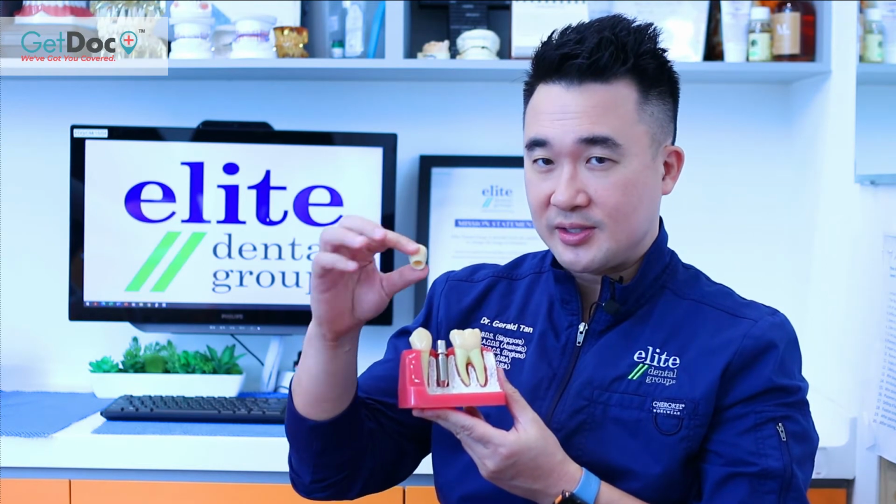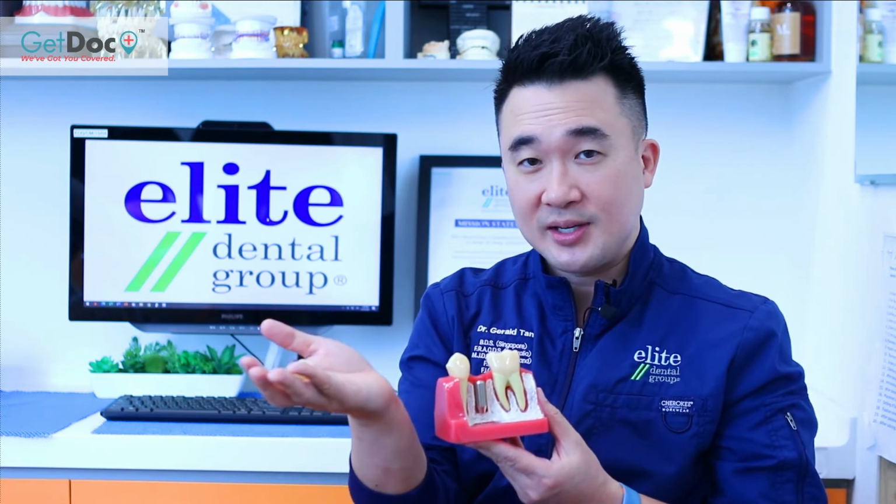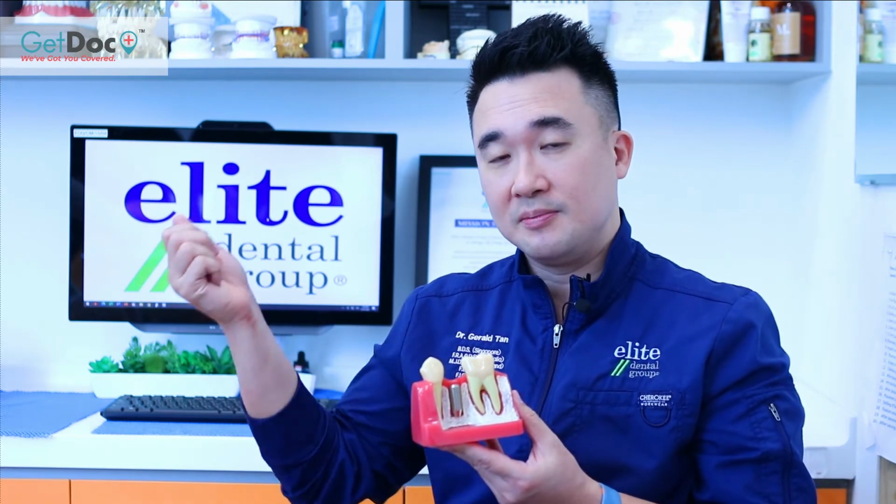So when the dental implant fails, several things can be done depending on where the failure lies. If the failure lies on the prosthetic components, which is the crown or the abutment, then it's a simple matter of removing the crown or removing the abutment. And when the broken parts are removed, we just make an order in the dental lab for new ones to be made. When a new abutment and a new crown is made, it's usually a simple matter of just installing it into the implant.